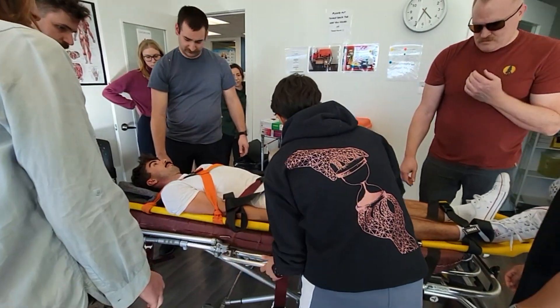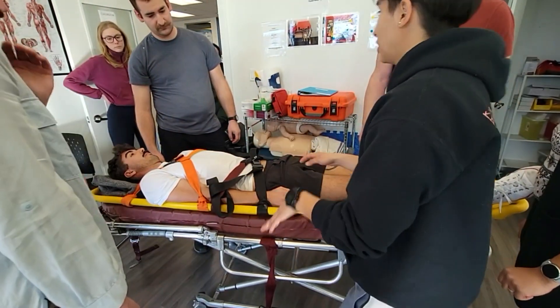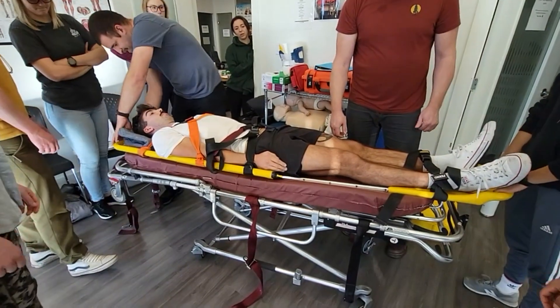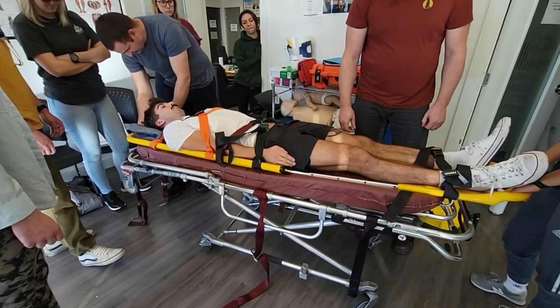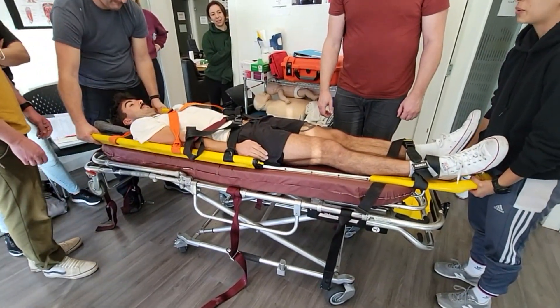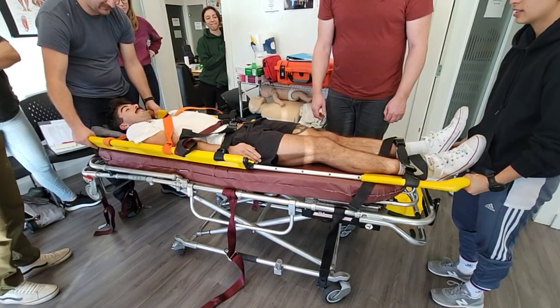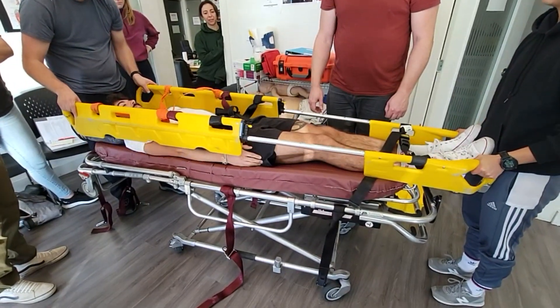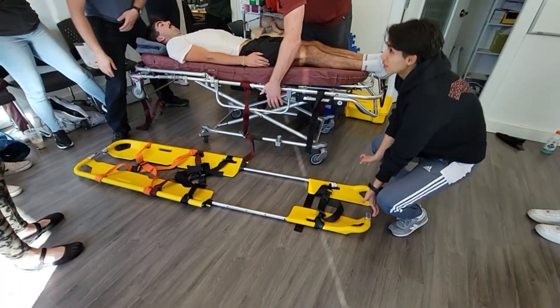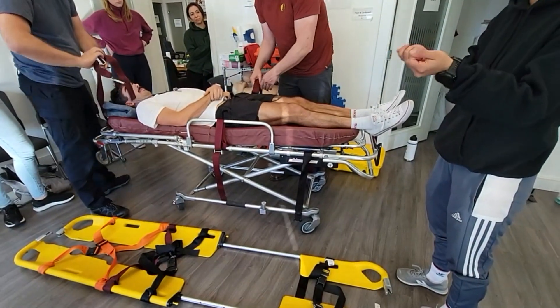Okay, so we're going to get the clamshell off. We're just going to bring these down. We're going to leave the buckles attached, not going to take them off. And then one of you down there, we're just going to basically undo the head and the feet. Good stuff. And we're very careful — we're going to explain to them: 'Hey, we're going to remove the clamshell. You might feel like you're falling, but you're not.' Then we're just very gently sliding it out and very carefully lifting. Leave the buckles attached so that when you pull this away, it's on the back face with all the loose buckles. Be very careful when you lift it over — there's no way around it.